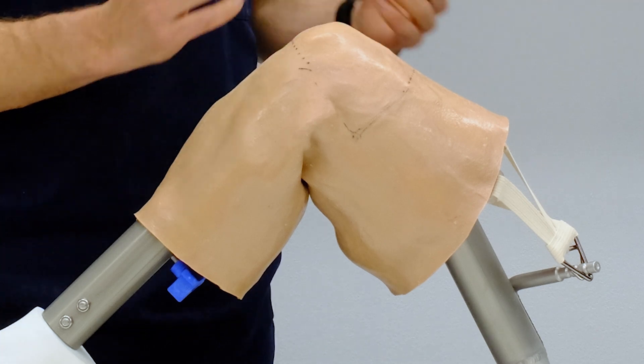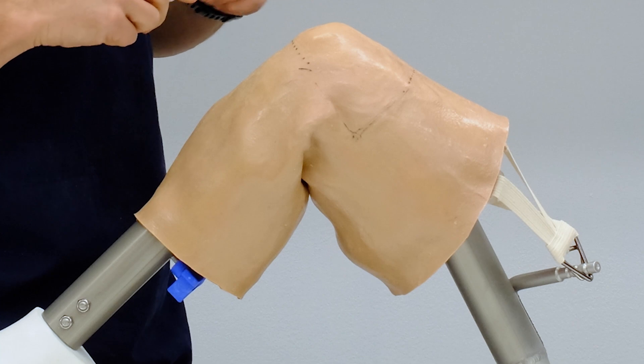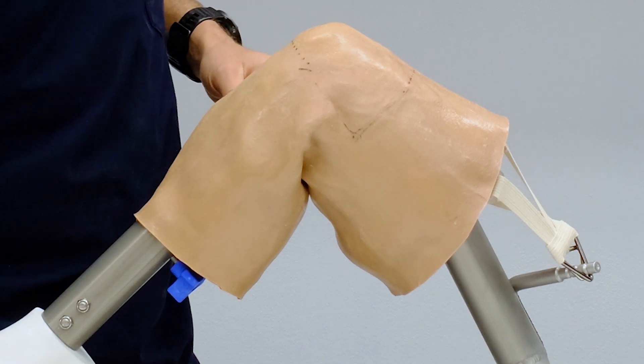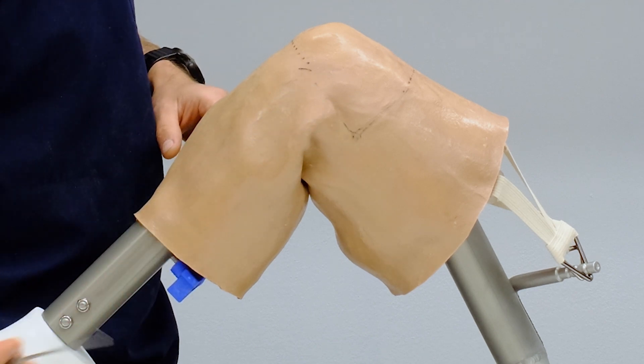Those Langer's lines have developed through flexion of the individual's limb, and I have used them independent of patient size to guide me towards my posteromedial portal placement.